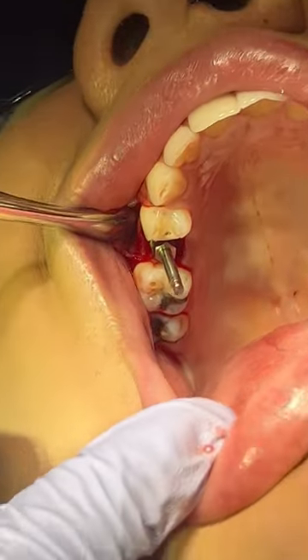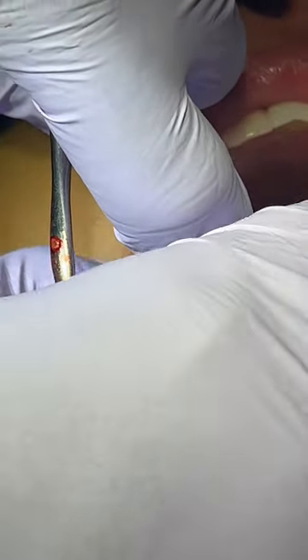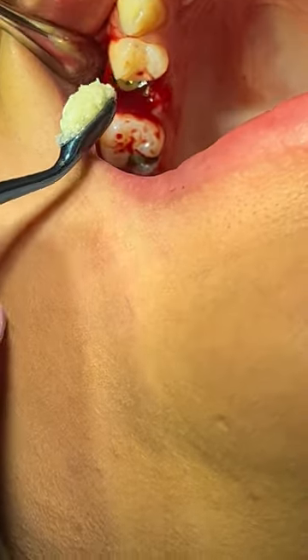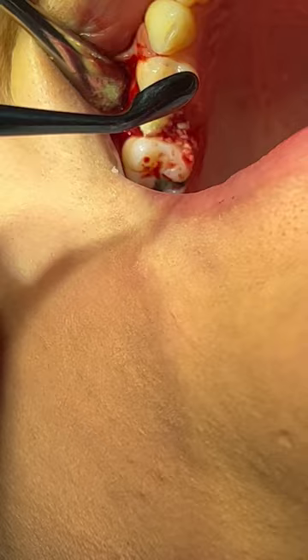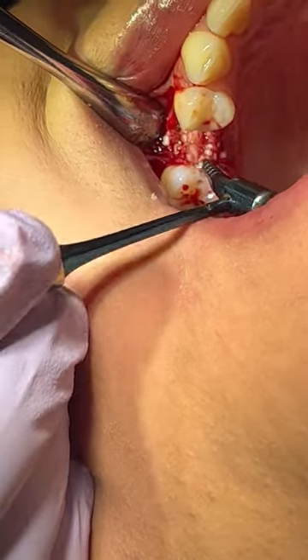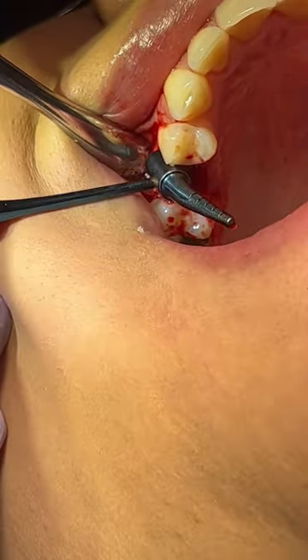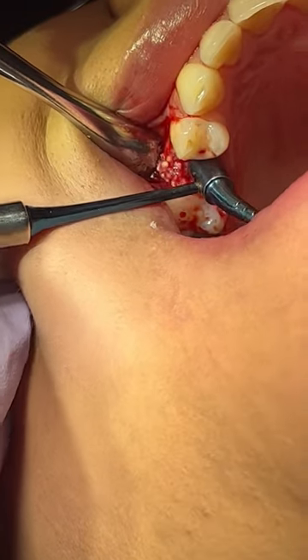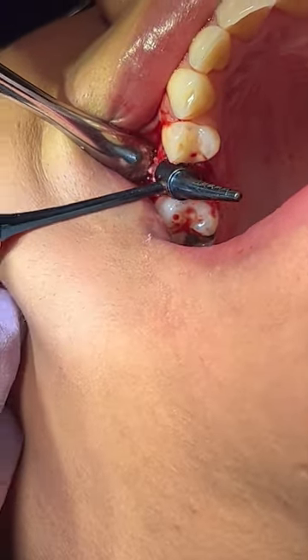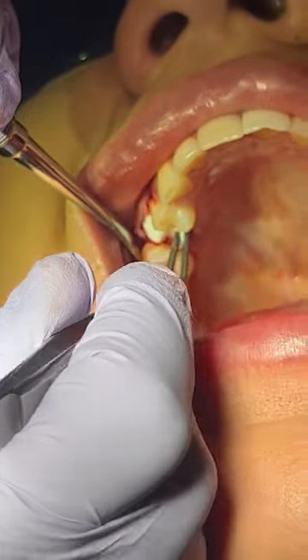We're checking the buccal plate and making sure that our angulation is correct. Now we're putting on the cover screw. I like to put cover screws — a lot of people put healing abutments; either way it works. This is when I go in and condense my bone within the buccal and lingual aspects, between the buccal plate and the lingual plate, and in between my implant. Condense everything. We have a spoon on one side and on the other side the condenser — I love this instrument. If anybody wants to know where I got it, please let me know and I'll tell you.